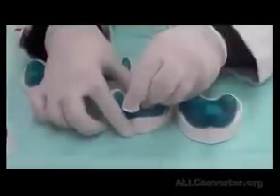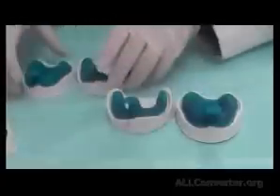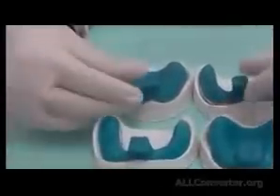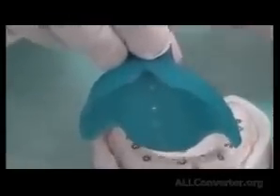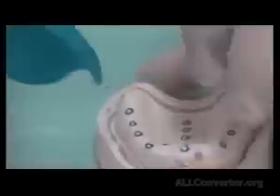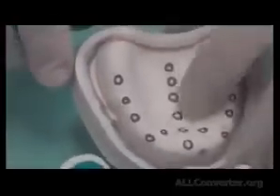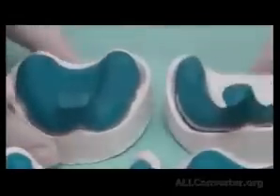So a partial spacer could be placed for this, or we can use a tray that has been previously fully adapted to the cast. After we finish it, or while fabricating it, we make holes in it. These holes will act as pressure release areas where the impression material will escape through them, and so we will not have pressure on the areas where those holes are located. The only areas where we will have pressure are those on the sides here. So this is called the selective pressure technique.